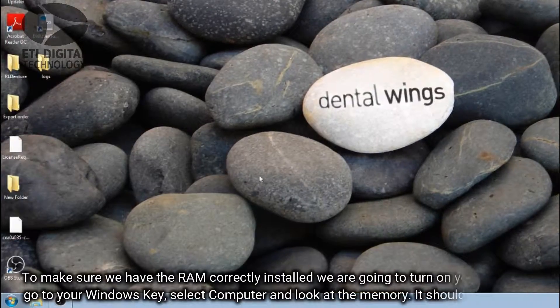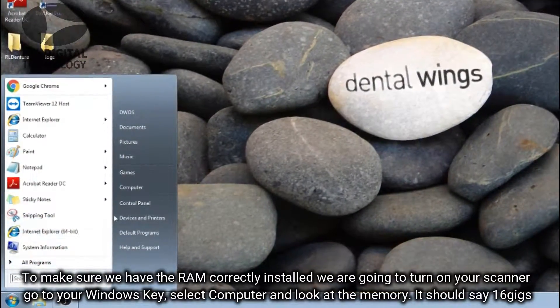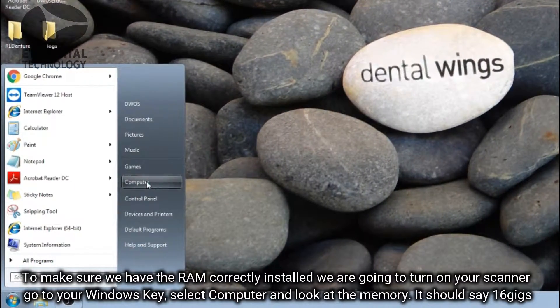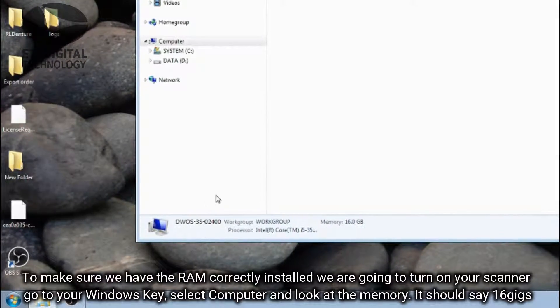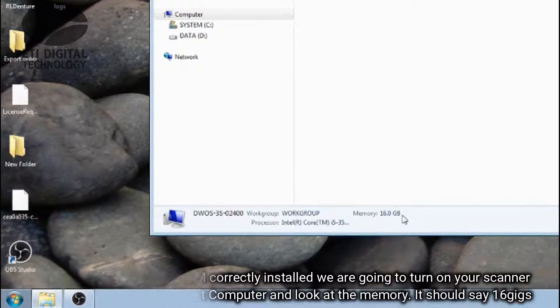To make sure the RAM is correctly installed, we are going to turn on your scanner, go to your Windows key, select Computer, and look at the memory. It should read 16 gigs.